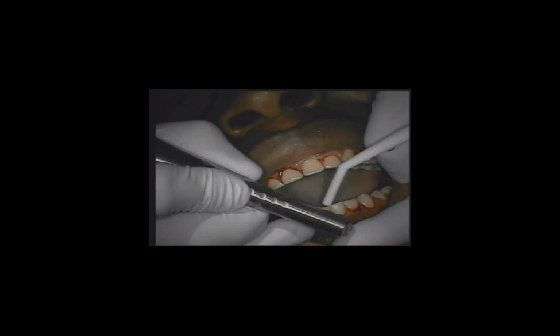So even though you're going perpendicular here to the tissue, your power settings seem like you're at such a low level that that's not going to do any damage to the tooth in any case. Right, minimal. You'll do more damage to the enamel removing the composite cement that's held the bracket on than you will doing this. Yeah, we're only using 1.8 watts, and then if we're staying at a slight bevel or angle, the amount of energy that's actually interacting with the tooth surface is even below that.